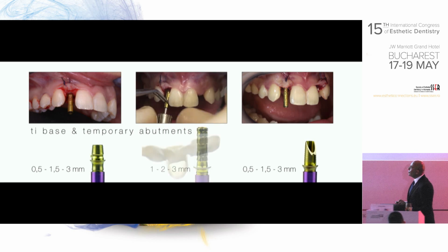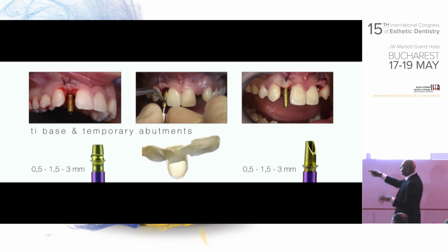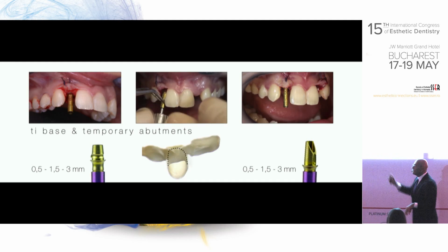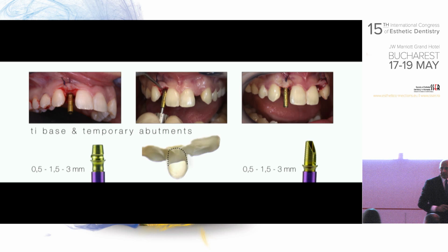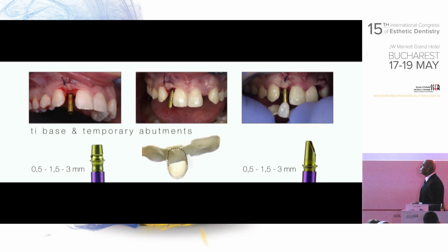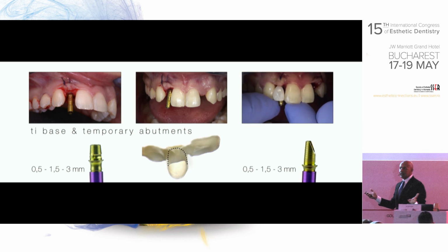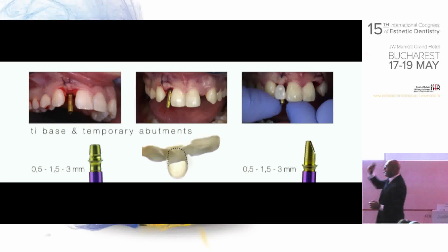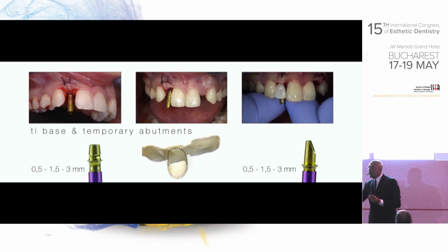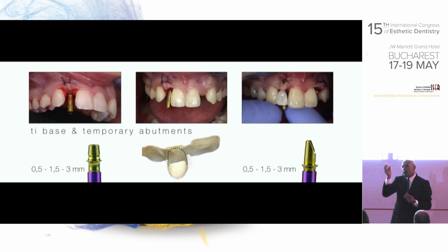And what I will do now is, in that Maryland crown bridge, I will open the palatal surface of this unit, simply position it over the implant, and the wings, I don't cut them yet. Why? Because if I had only the crown, I wouldn't know how to hold it. It could have been like this, like that, short, long.